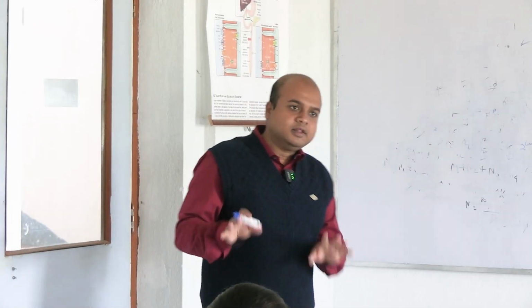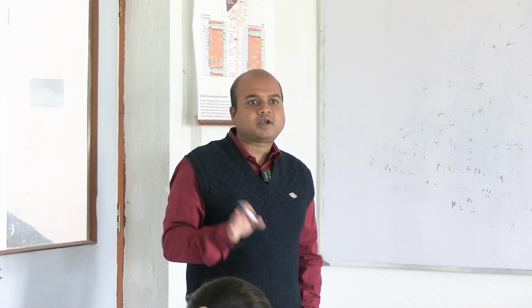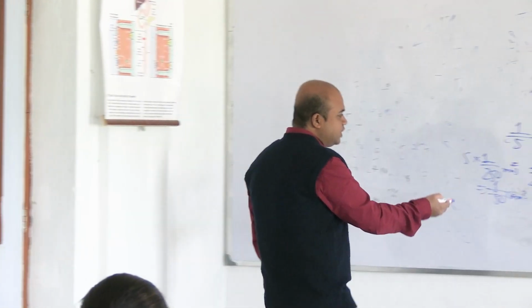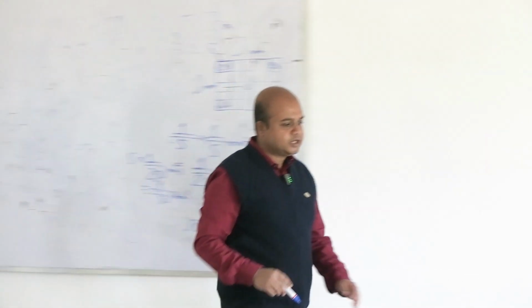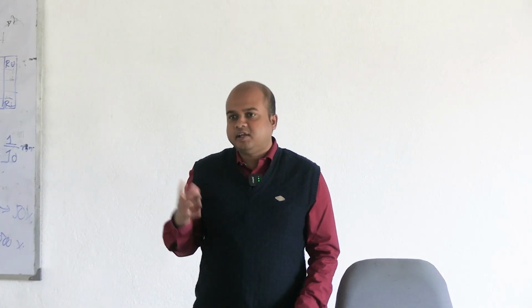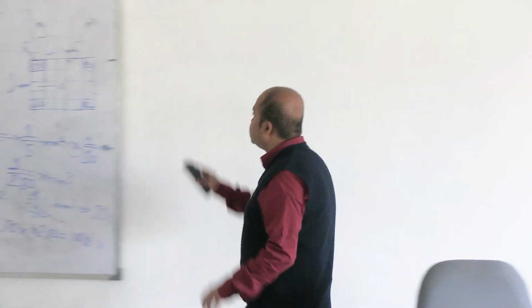So, dilution has to be done, and dilution has to be done in the standard figure which is given in books, because they did the experiments and arrived at this, that this dilution factor is sufficient so that the count is practicable. So, this was 50x, so we have to multiply it by the dilution factor we have got. So, the answer will be 10,000 x, and put x at last and just mention the result. So, that is okay. If say x is 523, then its result is 5.23 million per millimeter cube of blood. So, that is our answer.